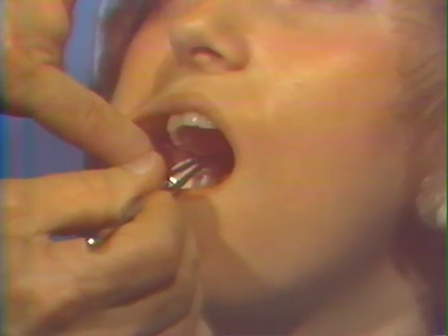The cotton is placed in between the teeth with it penetrating or pushing against the mucosa in the area of the coronoid notch on the anterior border of the mandible, and then ask the patient to bite the teeth together. Close your mouth now and hold it like that. That's good. Now open once again.